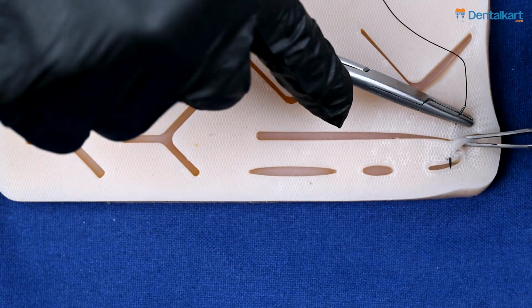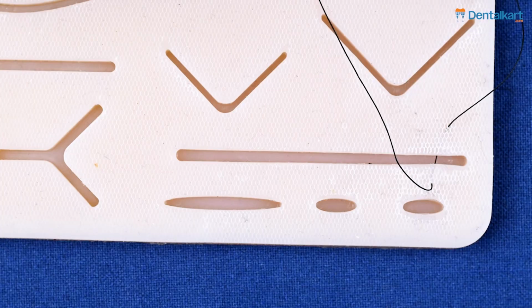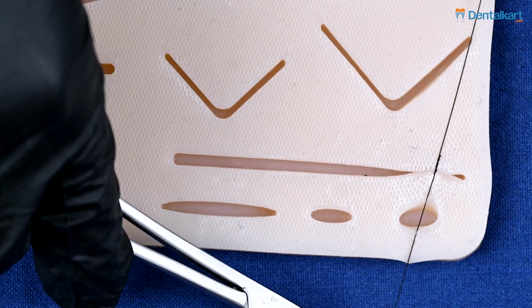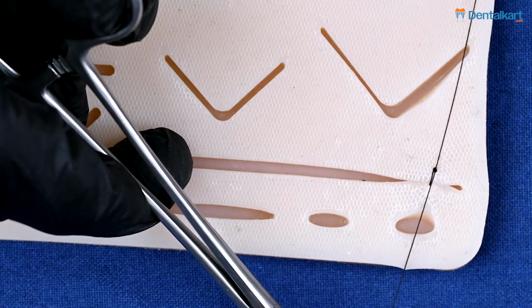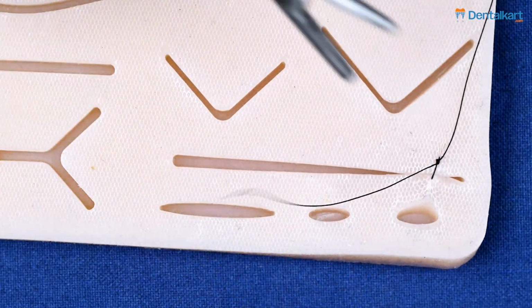In this video, we will be talking about a continuous locked suture. So, as you can see in the continuous locked suturing, the first step is to tie a simple interrupted suture and to cut the short end of the thread. So, this part remains the same as a continuous simple suture.